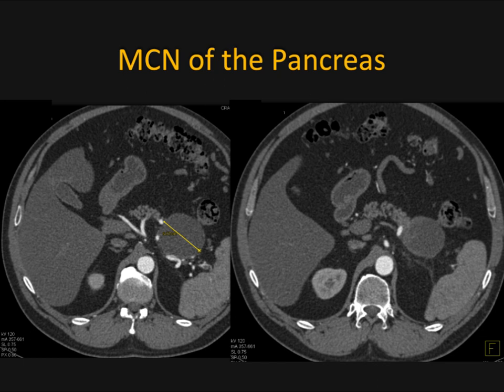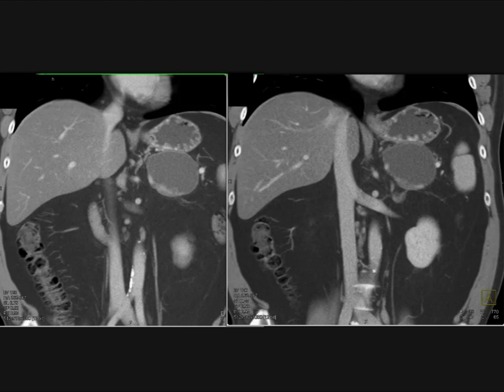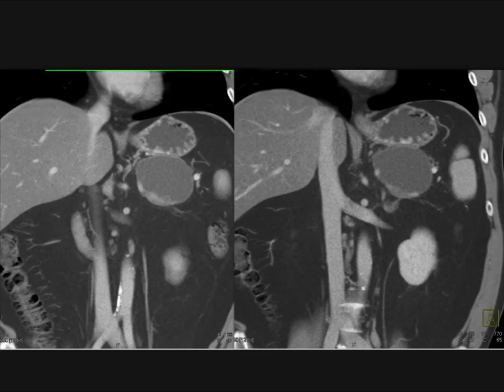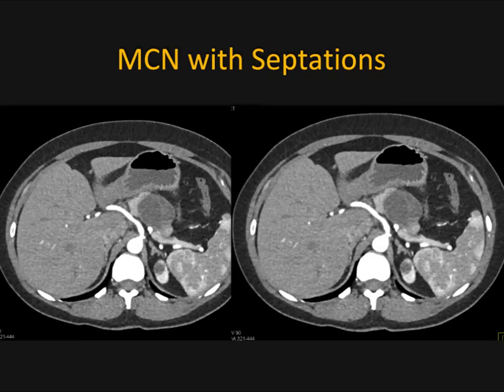Here's a classic lesion: a cystic lesion in the distal body and tail of the pancreas, well-defined, water density, measuring about six centimeters. The remaining pancreatic gland enhances normally, there's no evidence of dilated duct, no calcifications, and there is some asymmetric thickening in the wall of the lesion. You do need to be careful not to confuse partial volume averaging with the pancreas for wall thickening. One thing that makes a pseudocyst less likely here is the atrophy of the distal pancreatic gland.